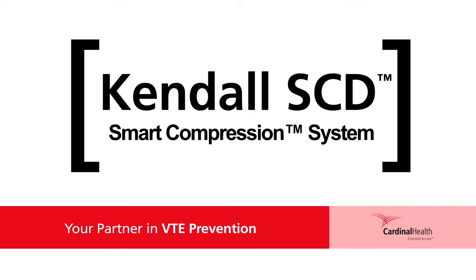Kendall SCD Smart Compression System, your partner in VTE prevention.